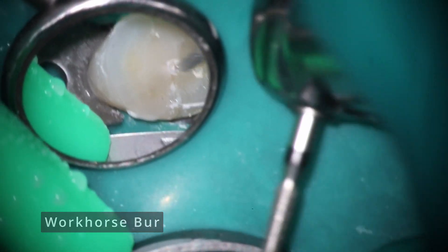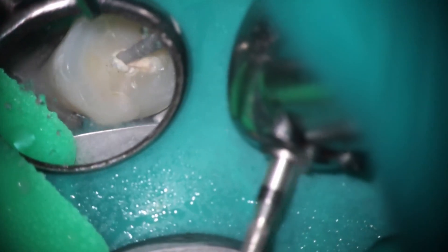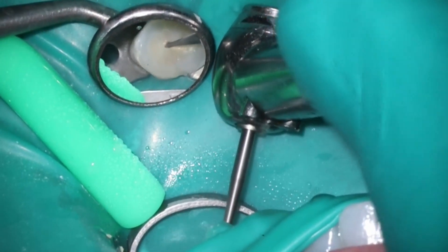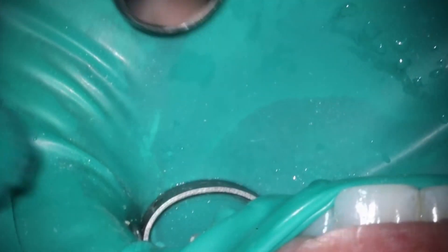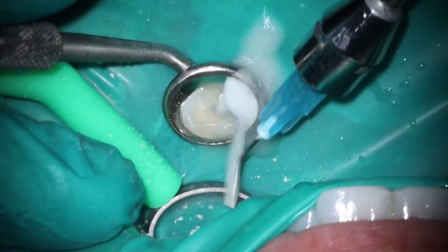Starting with a workhorse burr — this is actually my third take because I kept saying 'worker.' You'll see I'm having a little bit of trouble getting my initial point down inside. I do know this is going to be a two-canal case based on the cone beam. Whenever I have problems with the initial access, I switch to the EG3. Use the long axis of the tooth to line it up — it's a really skinny arrowhead shape that does a great job of penetrating. Then I switch back to the workhorse to connect the buccal-lingual and do my trough. Access is pretty much done, rinse it out, and we'll start the initial process of filing.